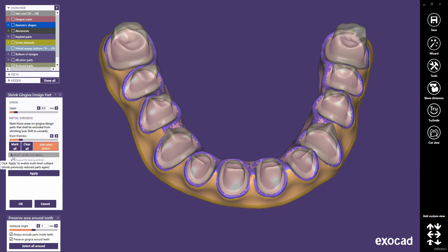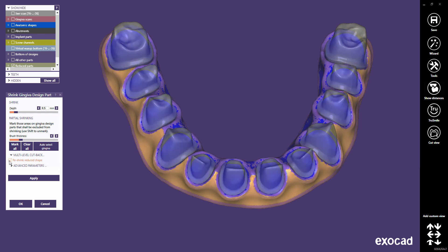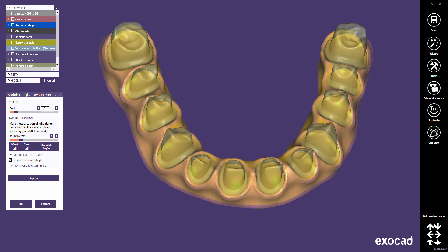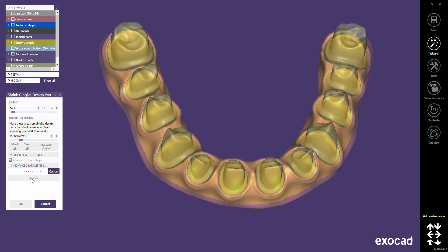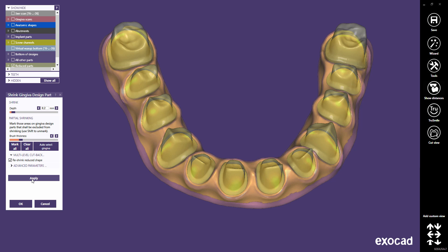Then we activate Multi-Level Cutback. We clear all excluded parts and we choose a second shrinking depth of 0.2 mm. This will now be applied to the whole restoration. There is also another method for gingiva cutback, which will be covered in a separate video tutorial. We click on the OK button to close this dialog.